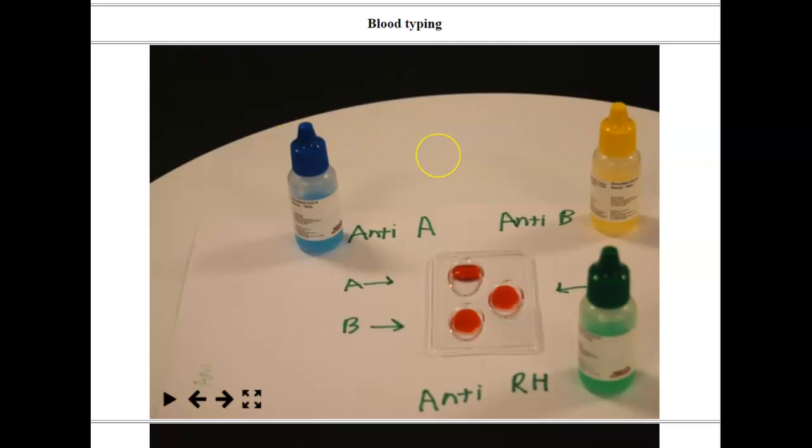And some of the students, when I did this in anatomy, were confused or frustrated. Just go to the end, try to read it off of this. This is agglutinated, this is not agglutinated. And please email me if you have questions. Thank you.